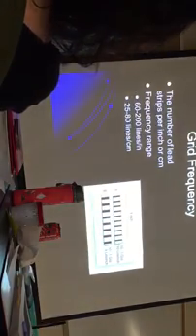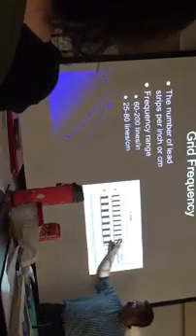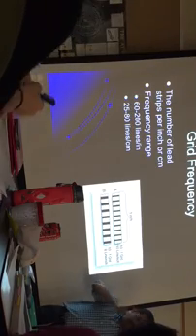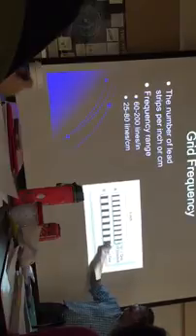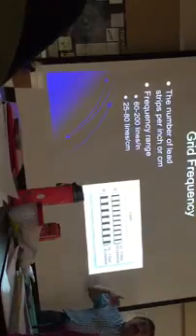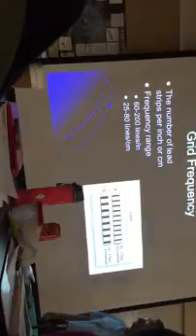All right. So now, why do you want to change the grid frequency? The reason is that the more lines, the thinner and more lines you have, especially the thinner the lines are, the less chance of having visible grid lines. So with high frequency grids, you hardly see lines anymore. Remember, the problem I described before is that this is lead, and the thicker it is, the more obvious the grid lines are going to be. And so you want grids that have a high ratio, but obviously they become very expensive.